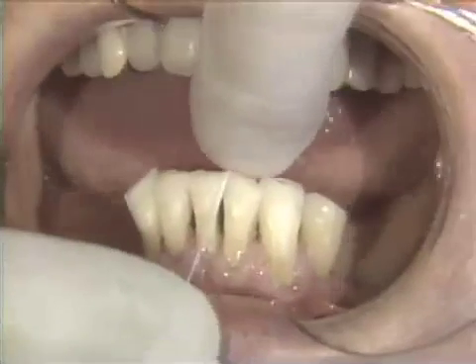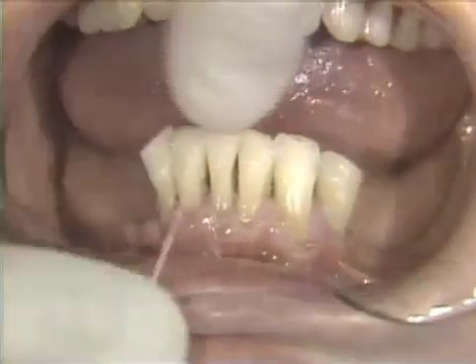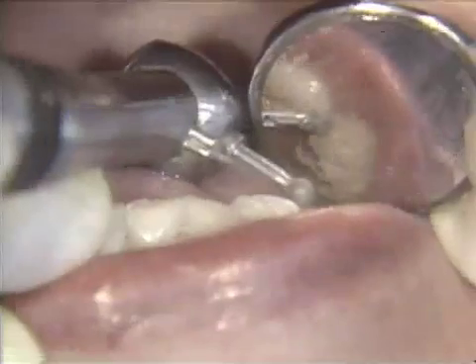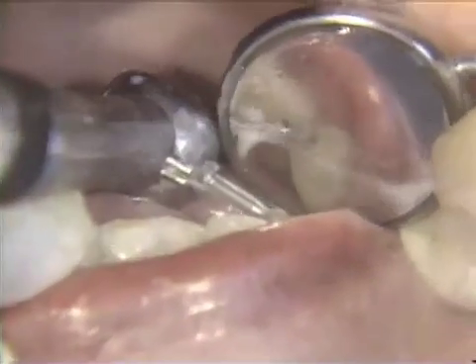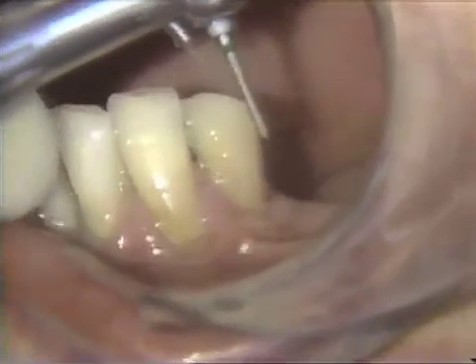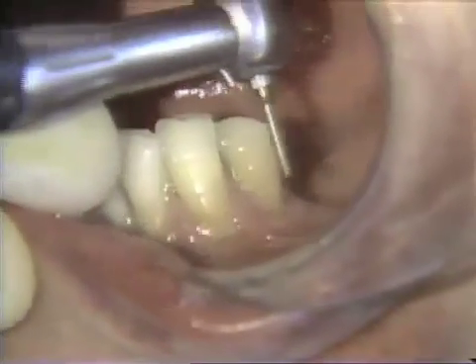The interproximal should be easy to floss. Check for overhangs or roughness which can trap plaque. The restorations are smooth and access is good for oral hygiene. A round diamond is used to place the mesial occlusal rest on tooth number 21 for stability of the partial denture. Re-contouring of the distal buccal of tooth number 21 is necessary to remove the excessive undercut which would interfere with clasp placement.